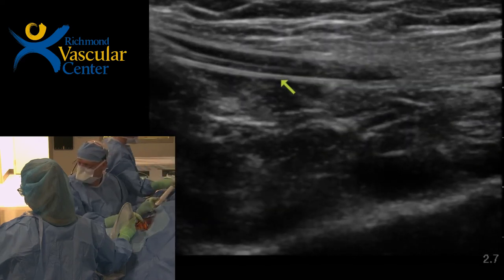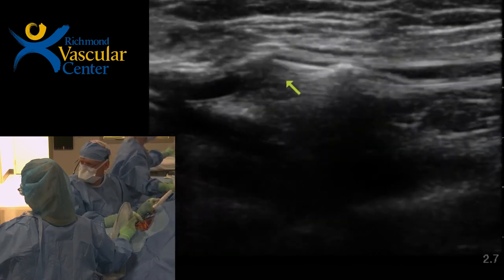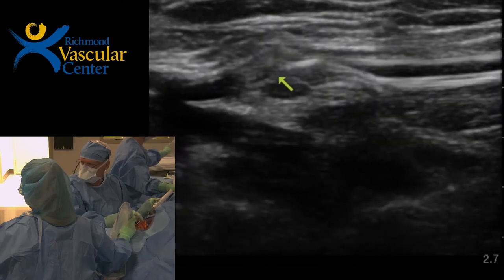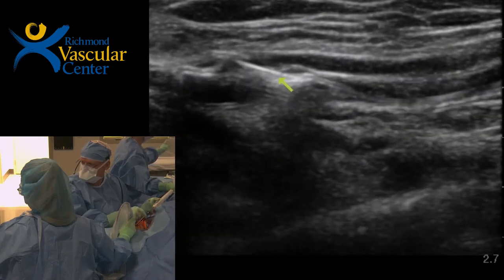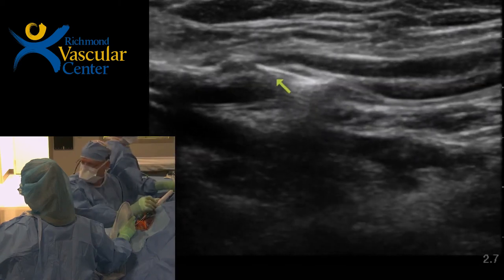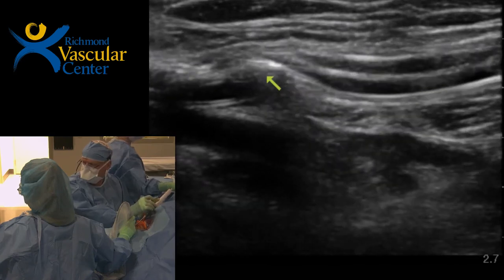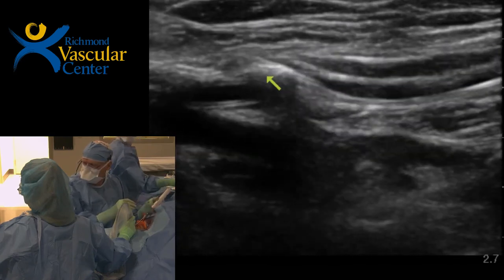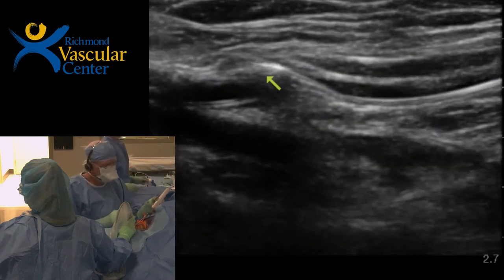So here I'm going to bring the device in, so it's all in. You can see that. I'm going to back it up a little bit. Now I'm going to pull the sheath off. Then you can see the tip's nicely in the artery. And I'm going to close it. And see how I have a good grip on it there. You can see all the tissue moving.